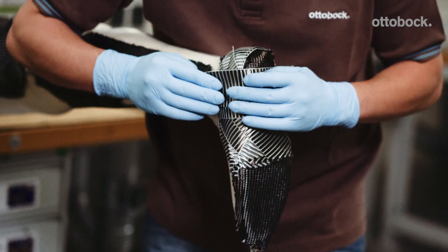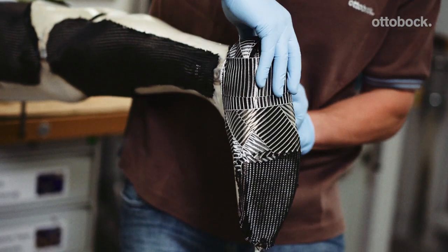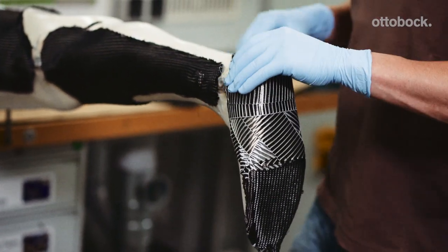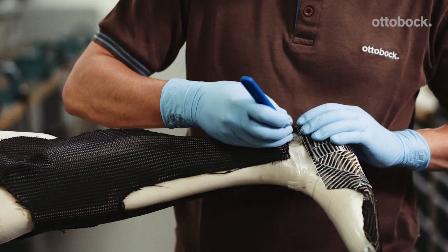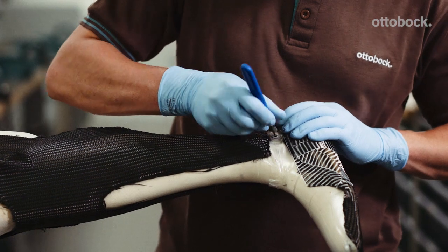Two strips of UD carbon are applied horizontally under the foot stirrup from medial to lateral. Using a knife, carefully make an incision over the thread of the joint alignment adapters.